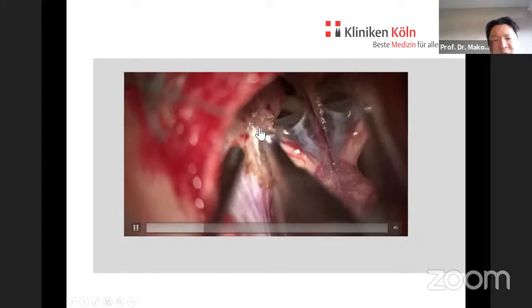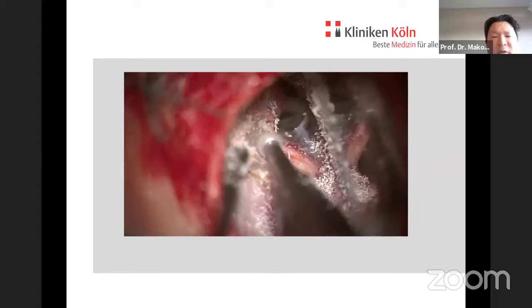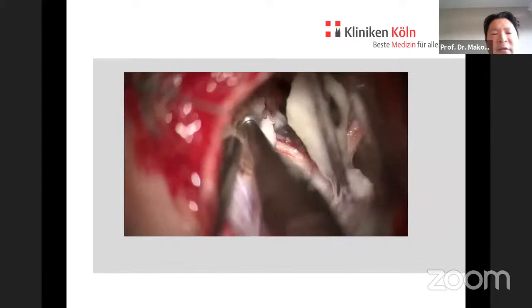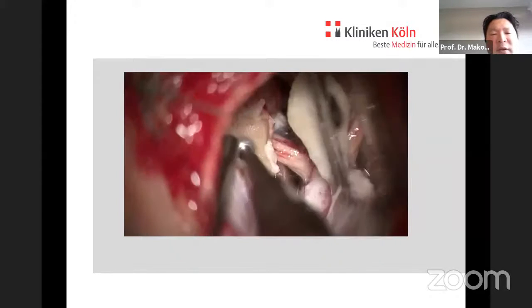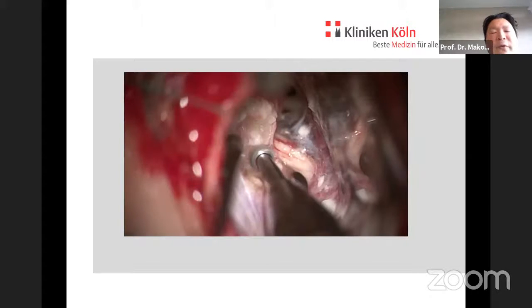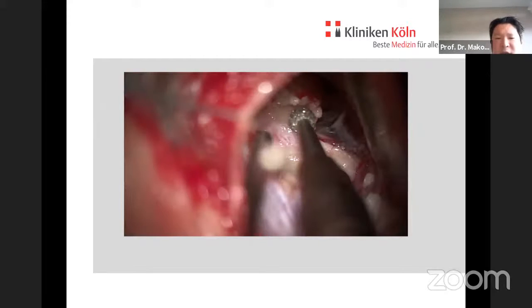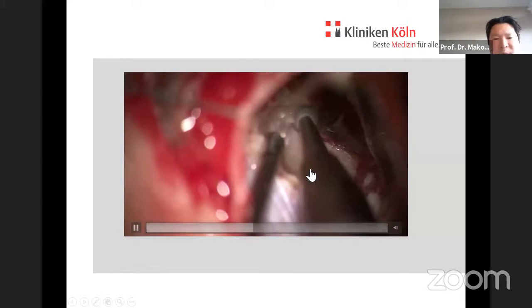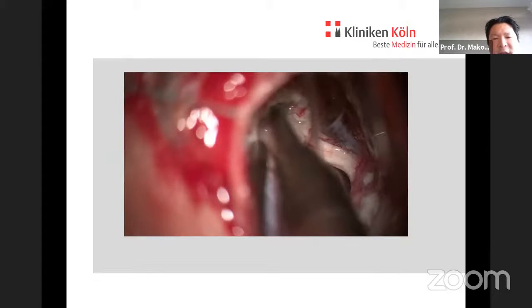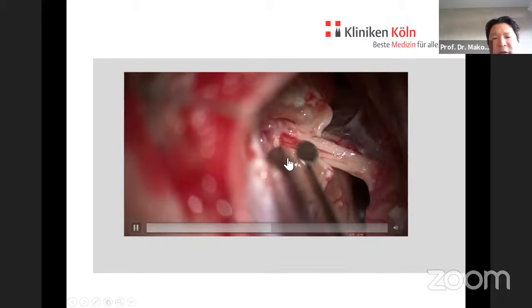At first I use a small Rosen burr to open the internal auditory canal and then later on proceed with a diamond burr. And then first the dura is exposed in the internal auditory canal. So this area is quite safe. You need to be careful in this area, of course.